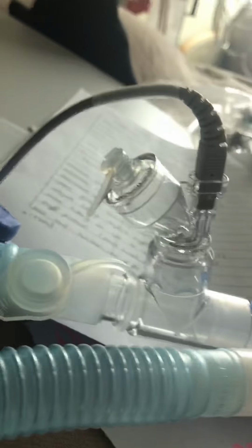So we're able to put the medication in there. We can switch this over to aerosol so we don't have to take this out. And then we turn this on and it does it inline. So every time the machine gives the patient a breath, they are receiving that medication.